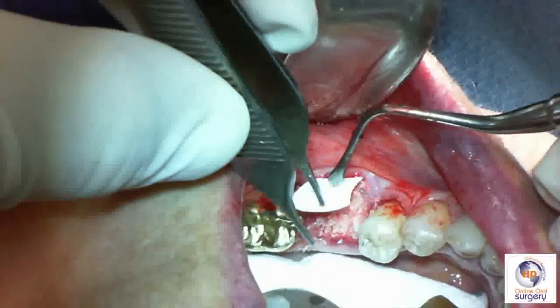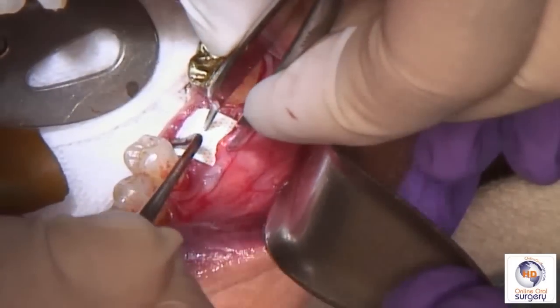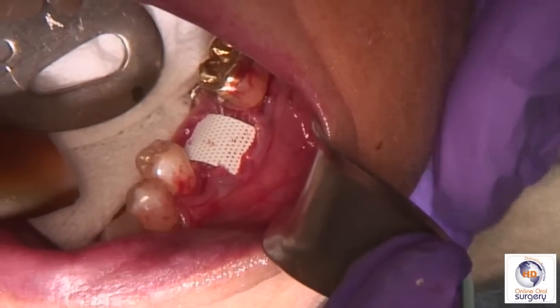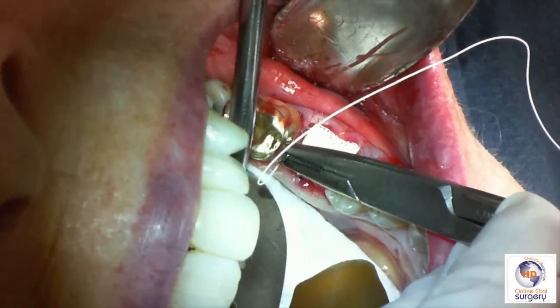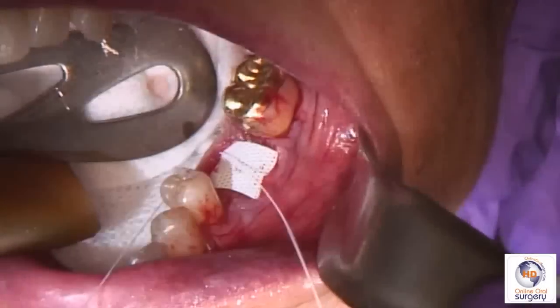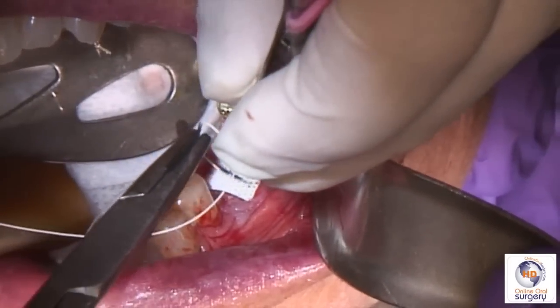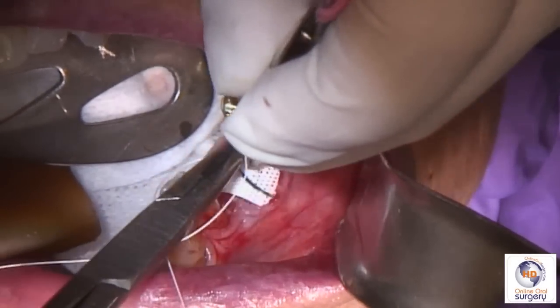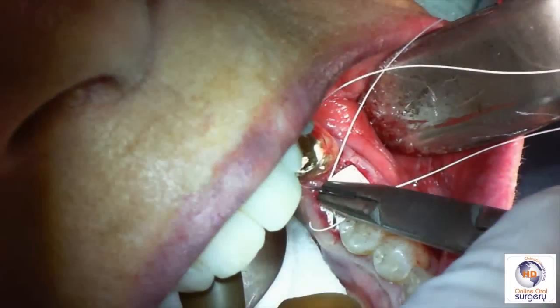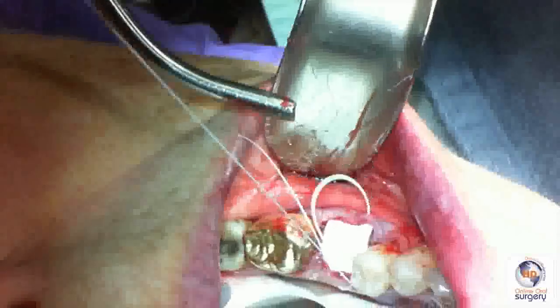Once we've completely filled the extraction socket with bone, we're going to take our membrane and tuck it in on the lingual into that pocket we developed. When handling the membrane, remember to use a non-toothed Adson forcep. We're going to put the lingual part of the membrane into that pocket and then suture using the Cytoplast suture. I like to start with a figure-eight suture where I start on the lingual going from inside to outside, then carry that over to the buccal and again go inside to outside, then carry back over to create our figure-eight.